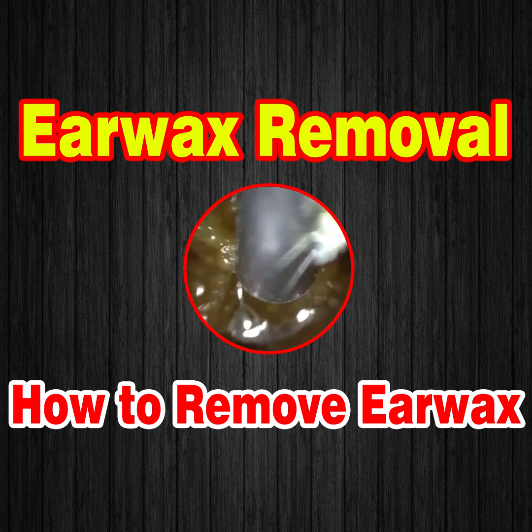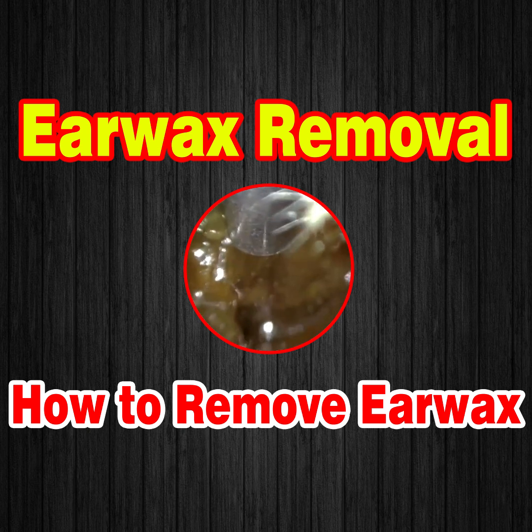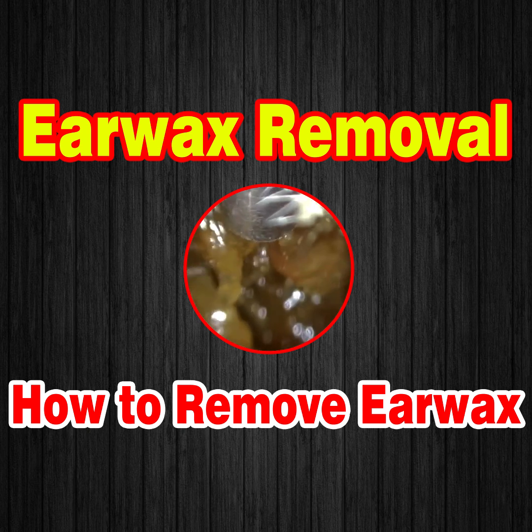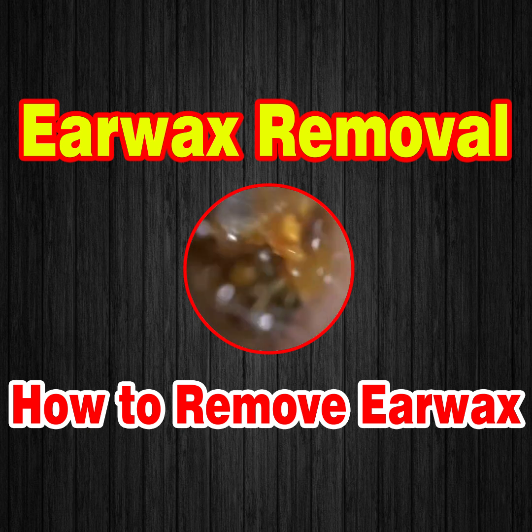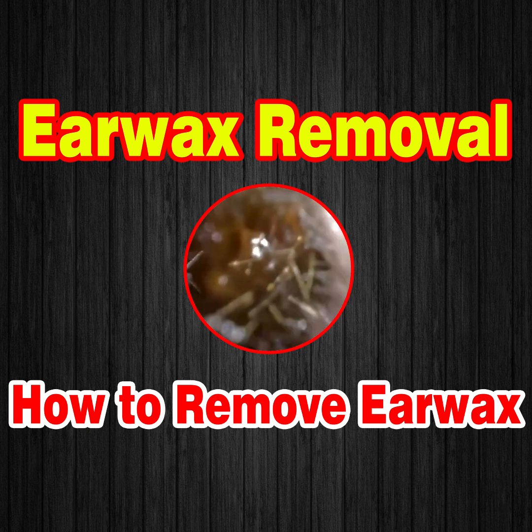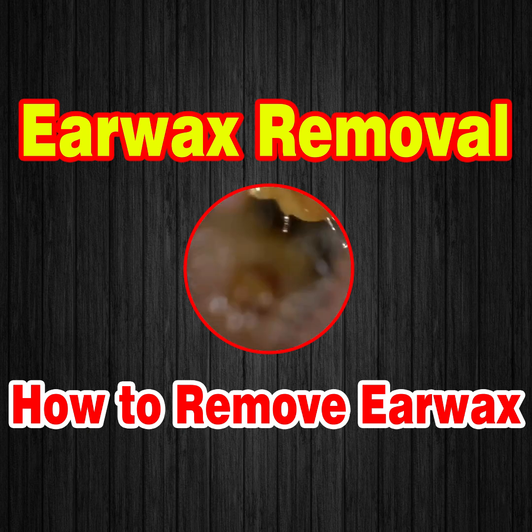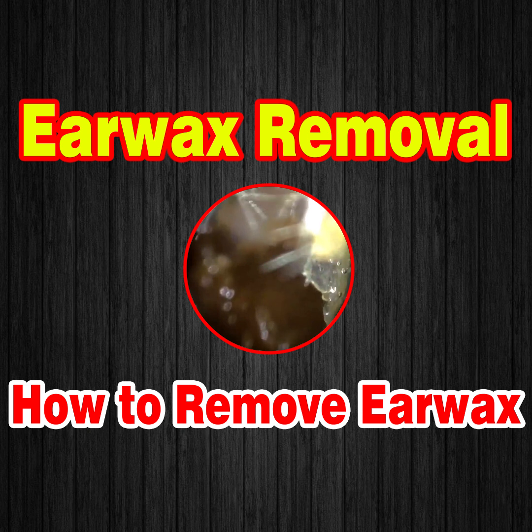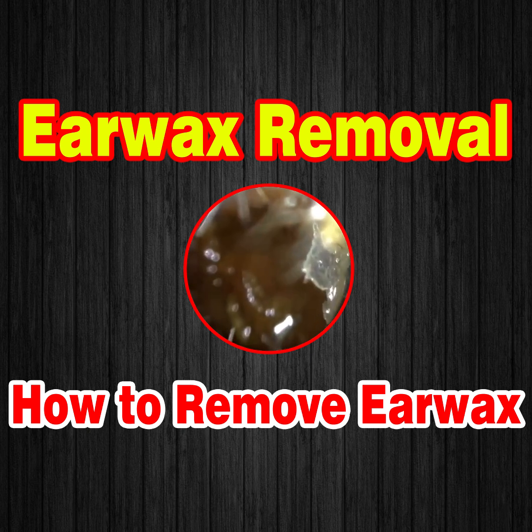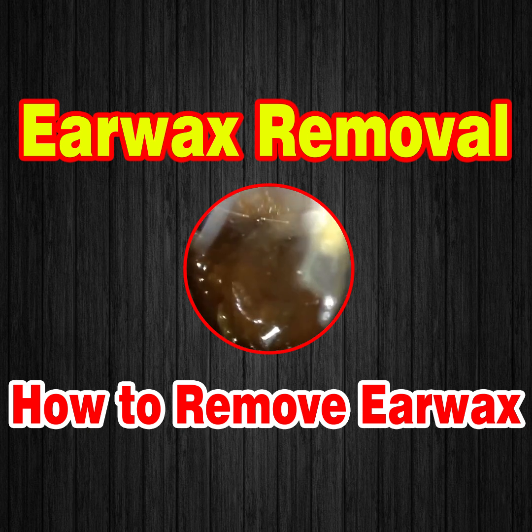I turned down the brightness slightly because of that skin type. I just didn't want that aural polyp at the entrance to cause problems. When you enter, you can get a lot of reflections. I just turned it down a bit, but it's just enough to still be able to clearly see the wax that are moving. And this entire ear canal is blocked from the entrance all the way to the eardrum. They have got a very narrow, bendy ear canal.